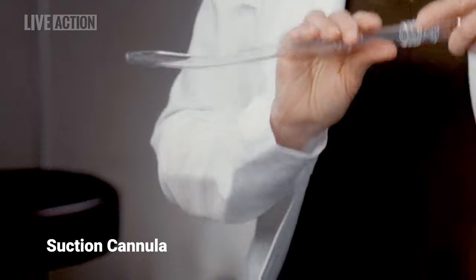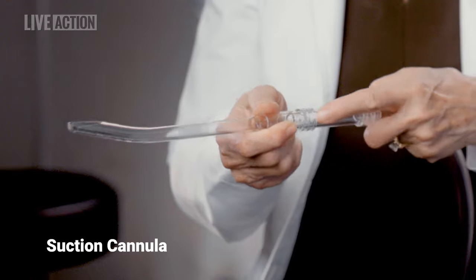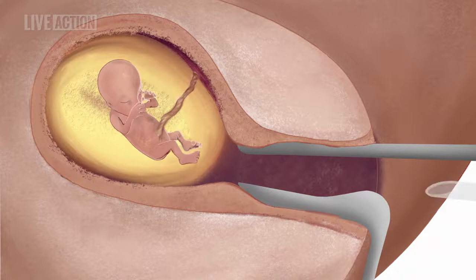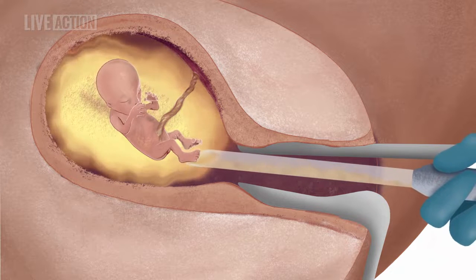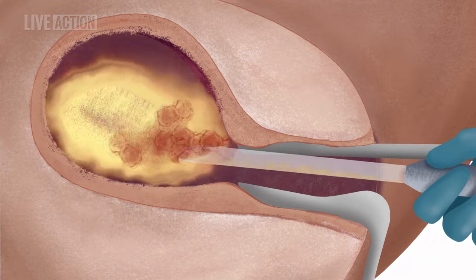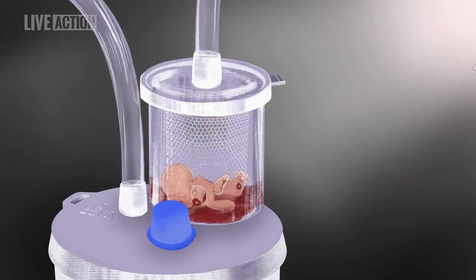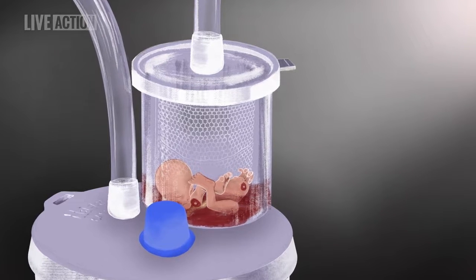The abortionist then inserts into the uterus a hollow plastic tube with a hole in it called a cannula and attaches it to suction. If the embryo is small enough, the cannula can be attached to a syringe, and manual suction alone will remove the embryo and placenta from the uterus. Otherwise, the cannula will be attached to a suction machine. The suction machine is turned on and the abortionist slowly rotates the cannula inside the uterus. The fetus is rapidly torn to pieces as it is pulled through the cannula and tubing into a large glass bottle, followed by the placenta. Sometimes smaller embryos are pulled through intact.